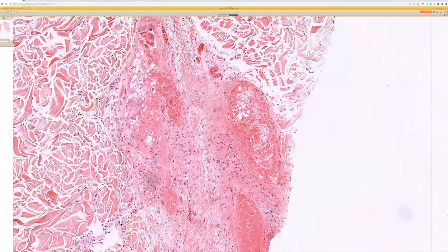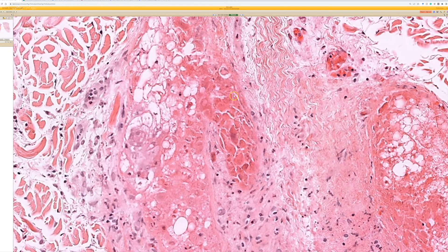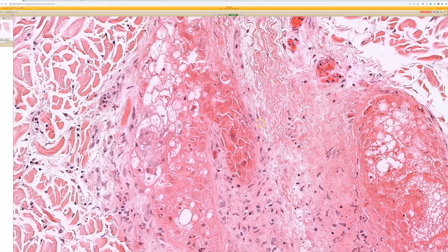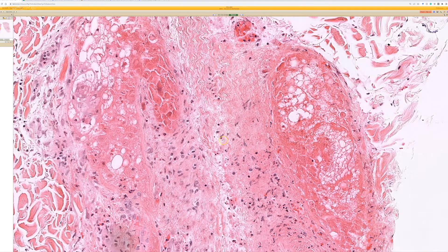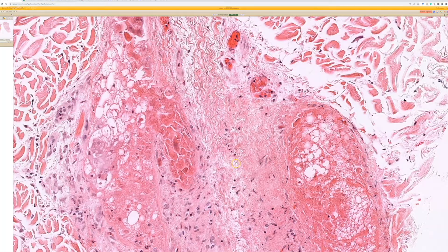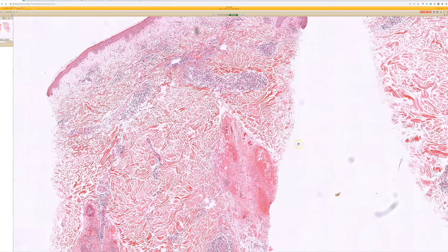Follicular necrosis is very good for VZV. That pattern of necrotic keratinocytes — even if I can't see the good nuclear changes — that is herpes until proven otherwise. If you can't find a convincing area, do the immunostain and it'll usually light up this stuff even if it's necrotic. The herpes immunostain is usually strongly positive and very helpful if you are in doubt. So herpetic folliculitis is more common in varicella zoster.